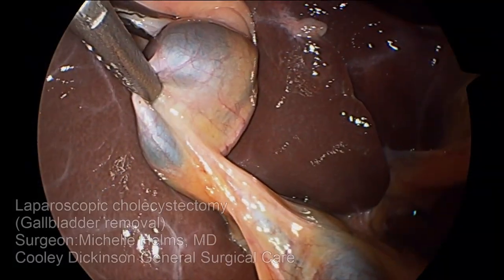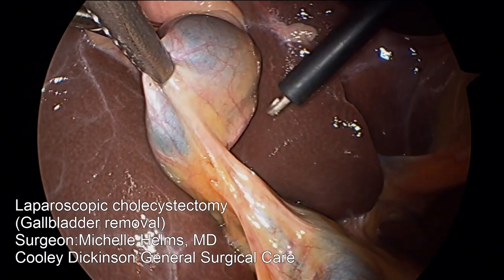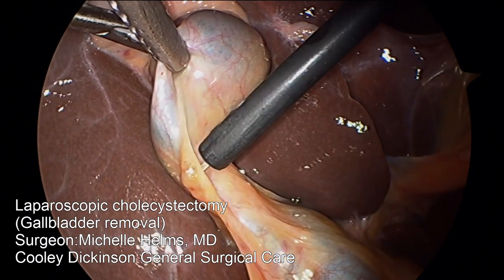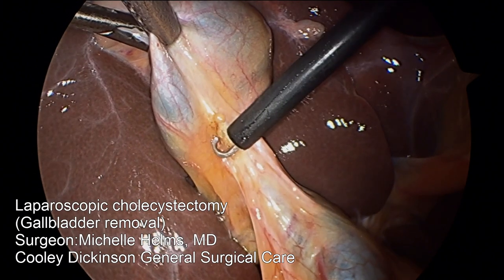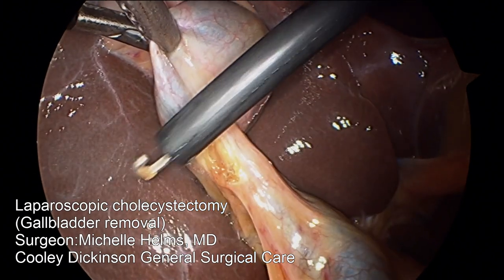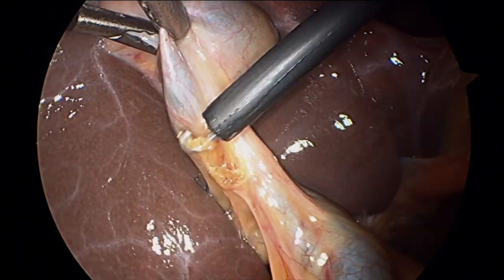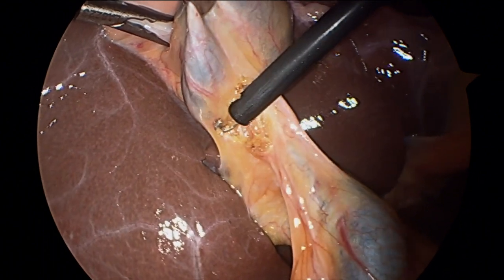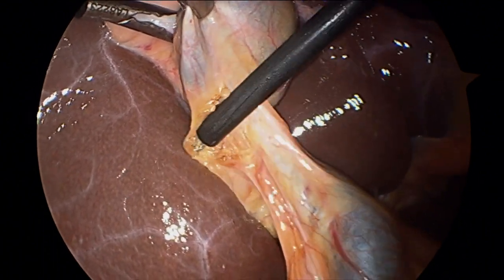We begin the tour once the belly has been filled with gas that lifts the belly wall off the intestines and the organs below. It's a minimally invasive surgery — there's usually just four tiny incisions. In this photo you see a grasper holding the gallbladder, and Dr. Helms introduces a hook cautery that uses heat to seal off tiny blood vessels, kind of like a little lightsaber to minimize bleeding. She has to open up the fatty tissue around the gallbladder that connects the gallbladder to the liver bed.